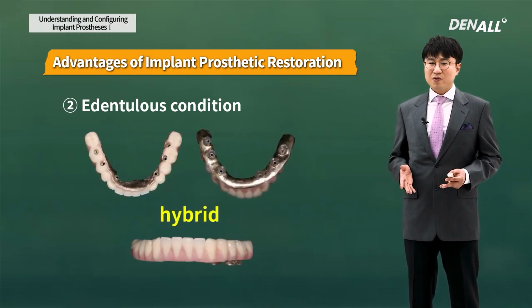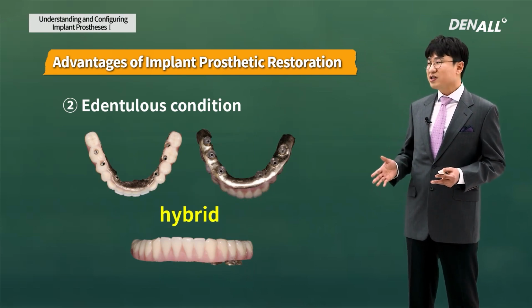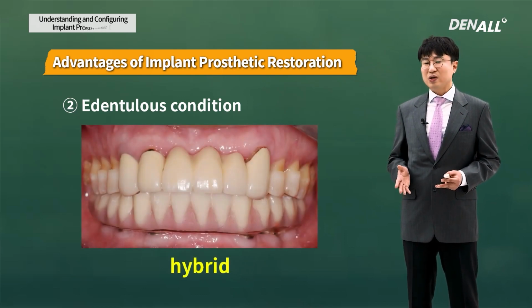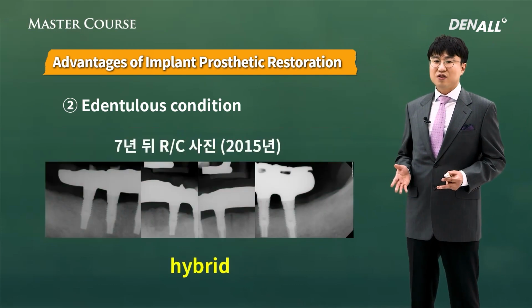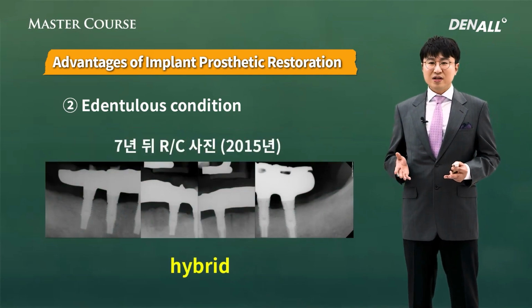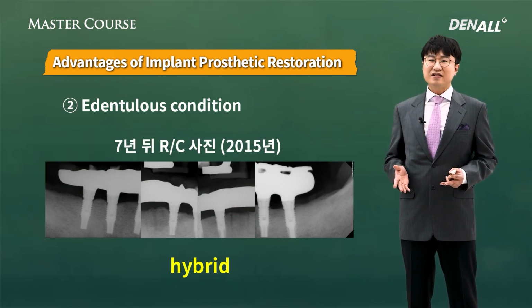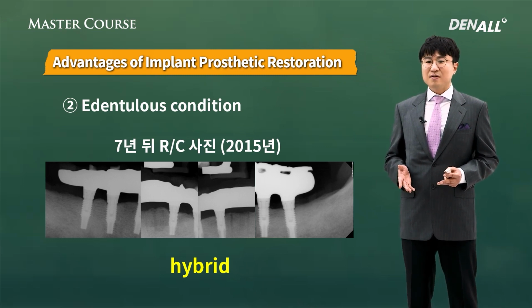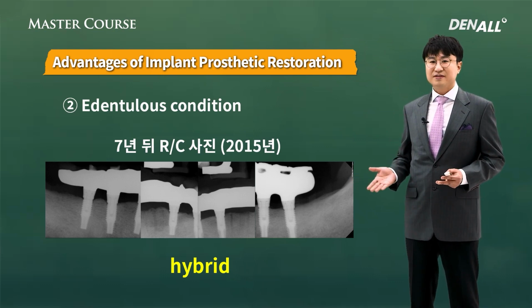Oral hygiene is hard to maintain, and as we have customized abutments now, we don't use this type anymore. But if you look back, with the hybrid type that used to be used, thanks to implants, for a long time patients could masticate very satisfactorily. So in the edentulous condition, again, implants can improve the quality of life of patients. In the master course, I'm going to teach you more about this.